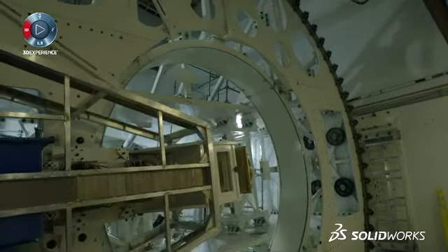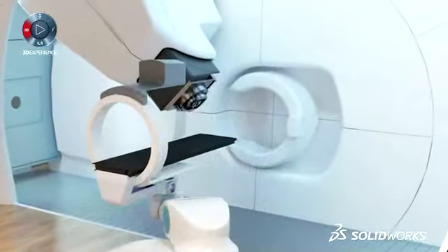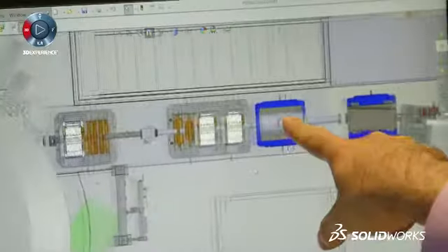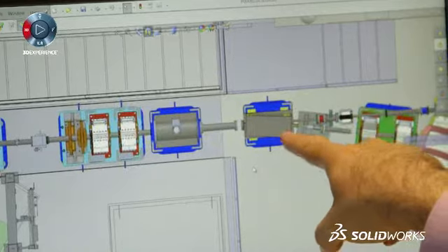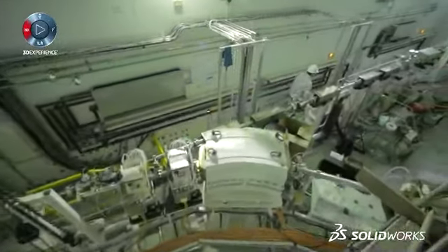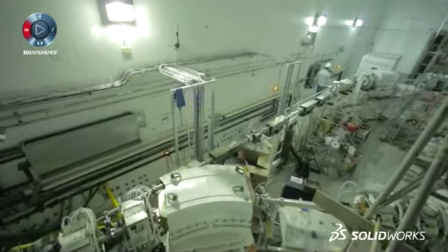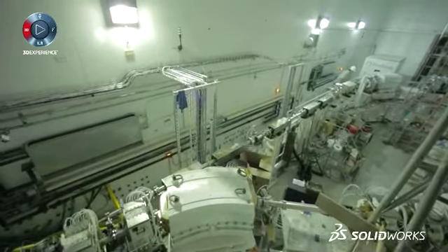Basically, you take water and you push a lot of power through there to rip out a free proton. That proton spirals around, and once it gets to the proper speed, it then travels through some slits, down about a 100-foot beam line, which then makes a sharp right turn. Once it's out of the cyclotron, the proton wants to expand, and so there are all these magnets in this beam line just to keep that beam positioned down that pipe as it's traveling through.